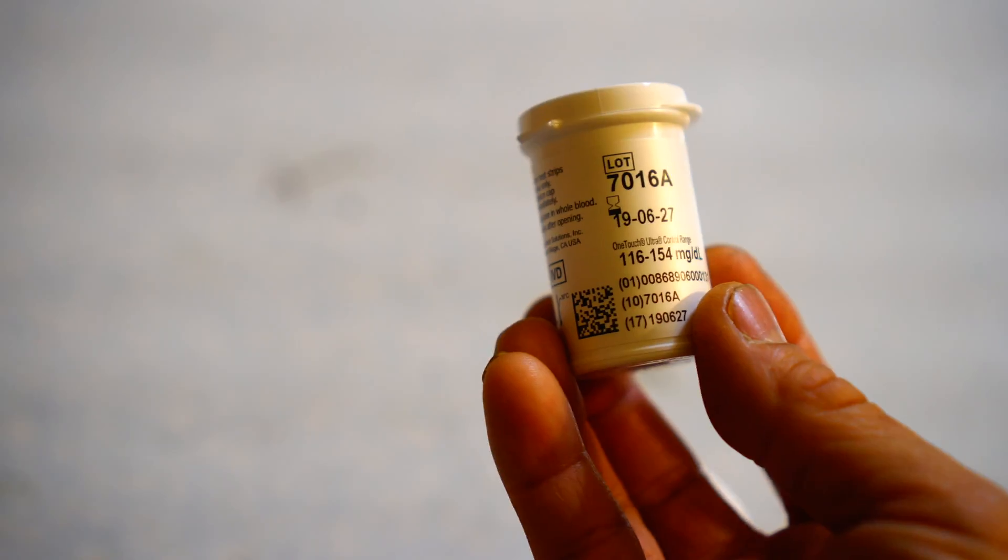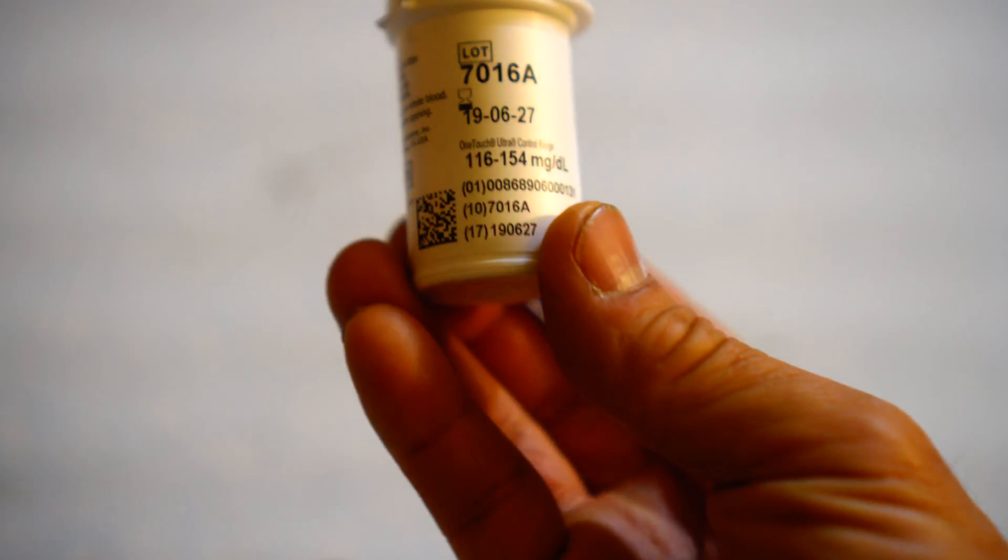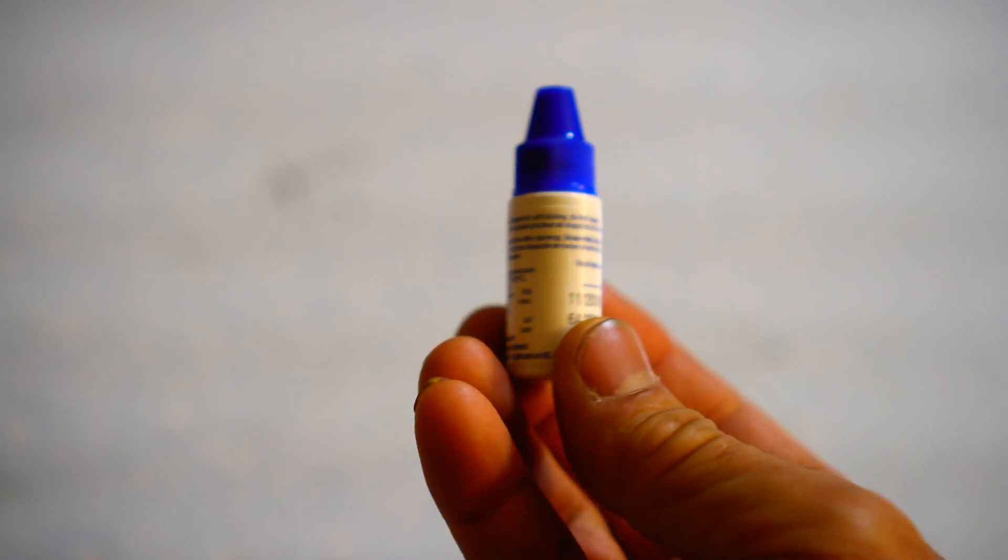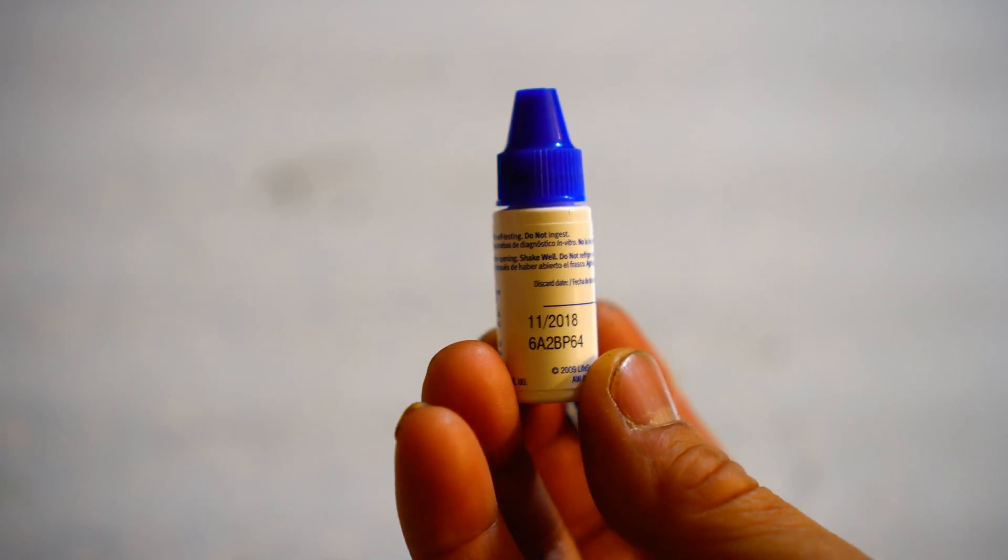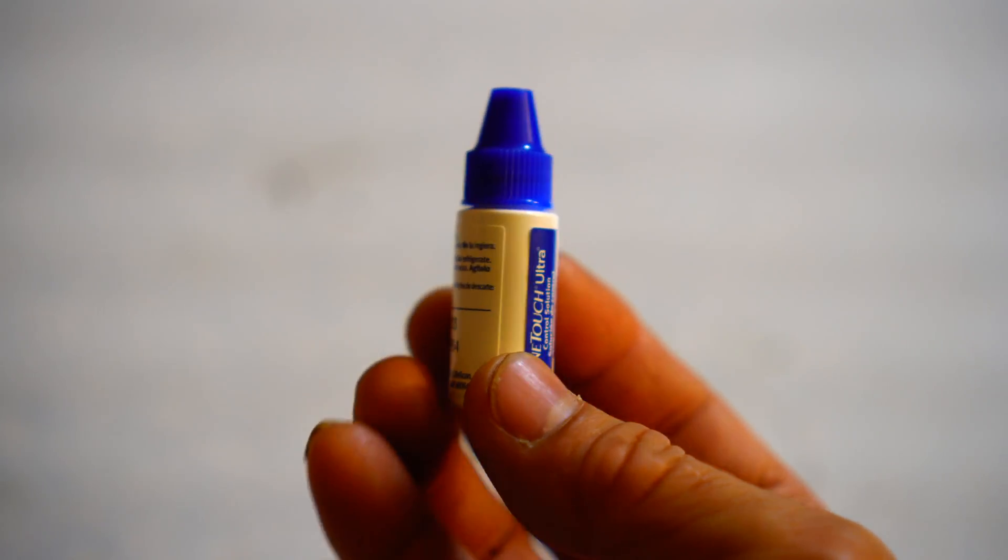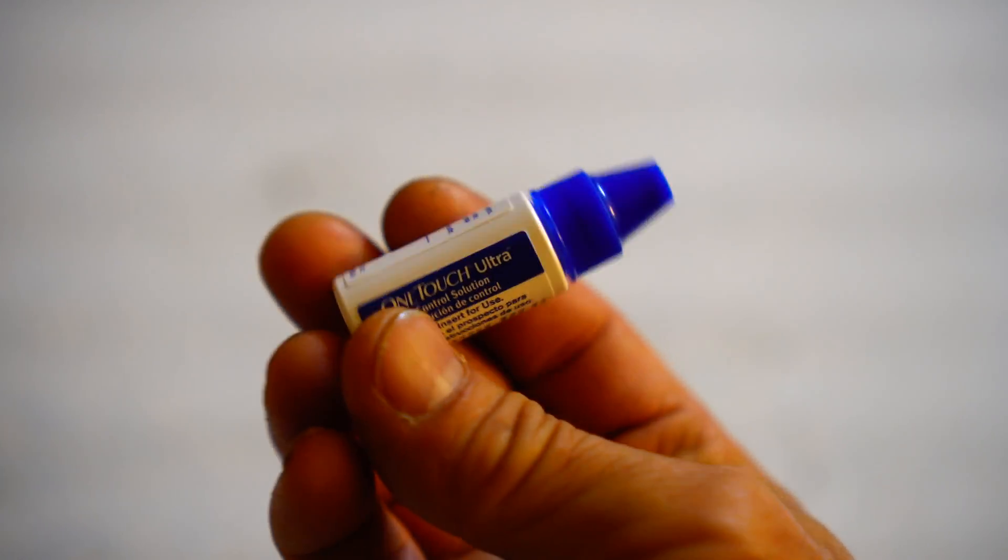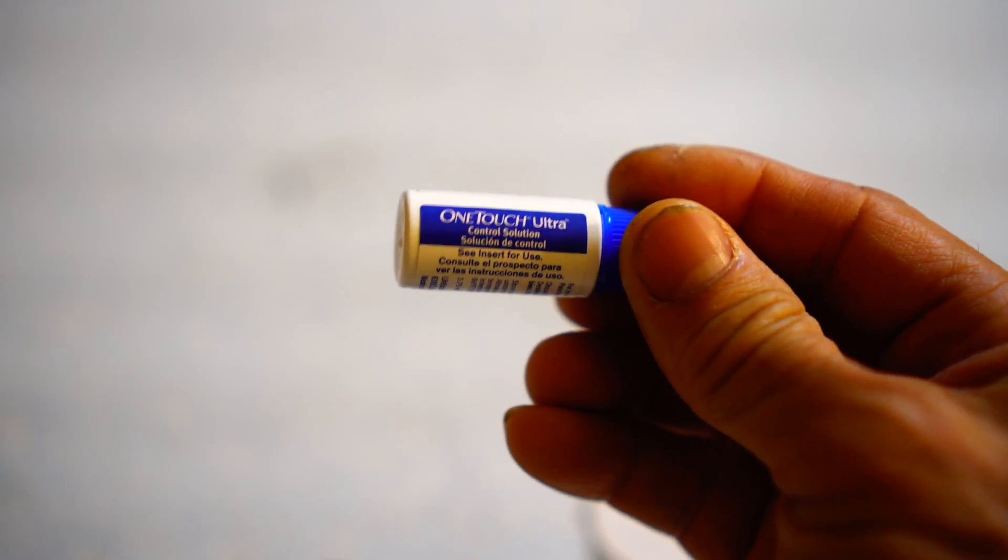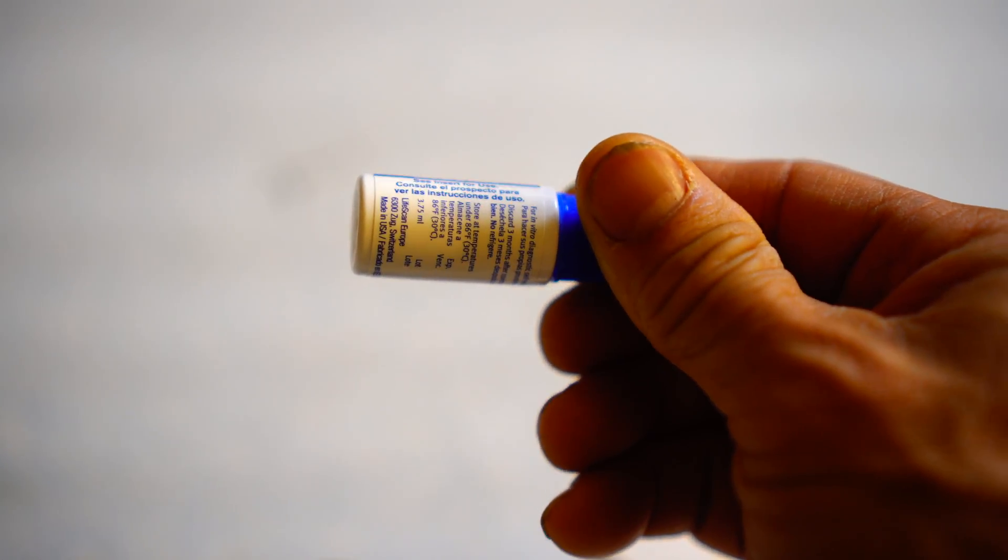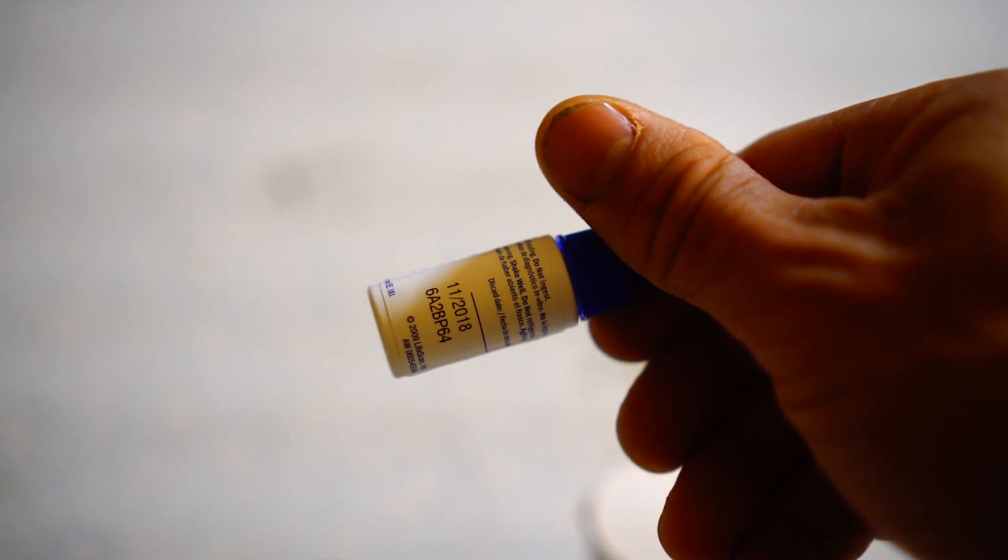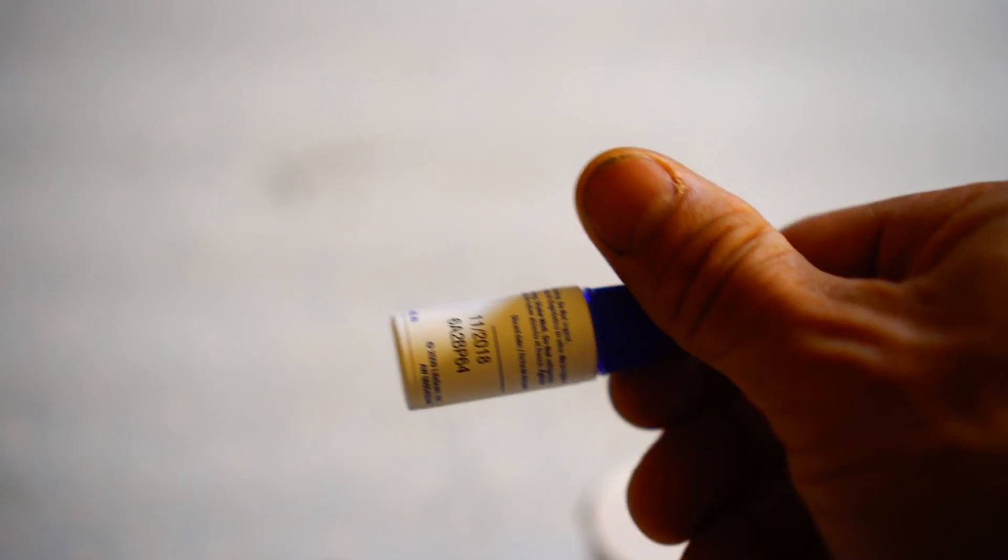Let me show you when I do some tests with the control solution. This is a fresh control solution I bought off Amazon. It's the standard One Touch Ultra Control Solution with an expiration date of November 2018. First off will be the One Touch test strip, and I'll use control solution to test that.